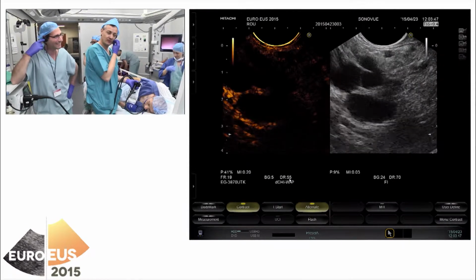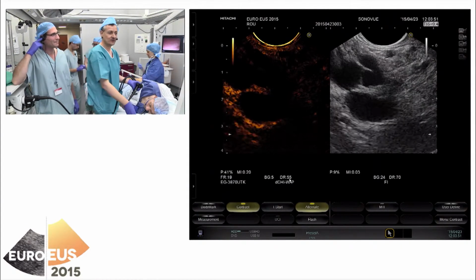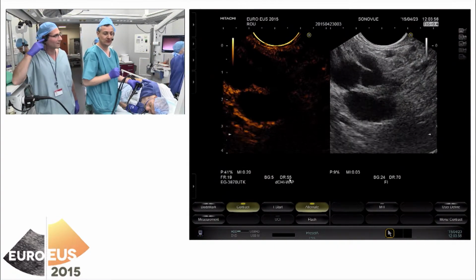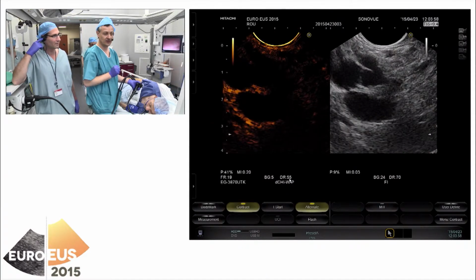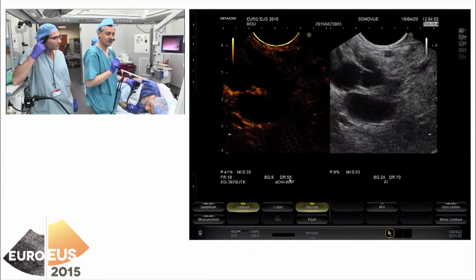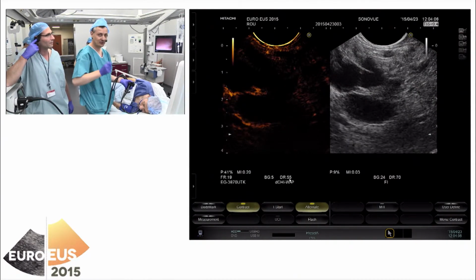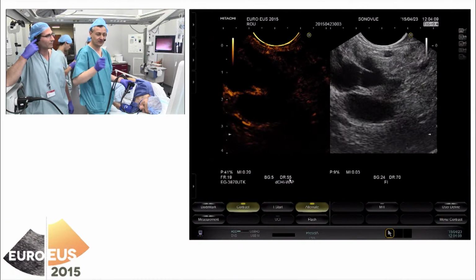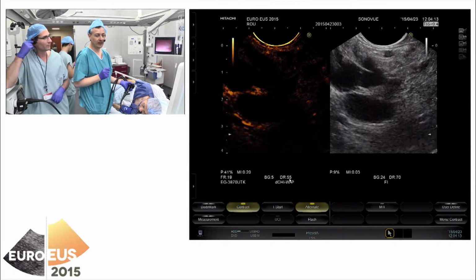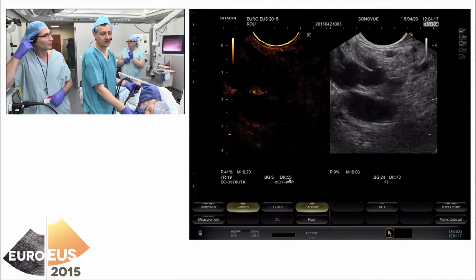It's a microbubble contrast agent, and it's a blood pool contrast agent. So it stays in the vessels, and this is an advantage as compared to CT and MR contrast agents. We have to mix it, so we have to shake it. The team here knows already how to do contrast, but you have to shake it very well because you need to make a lot of microbubbles inside the vial. And then we prefer to inject a whole vial for US examinations.